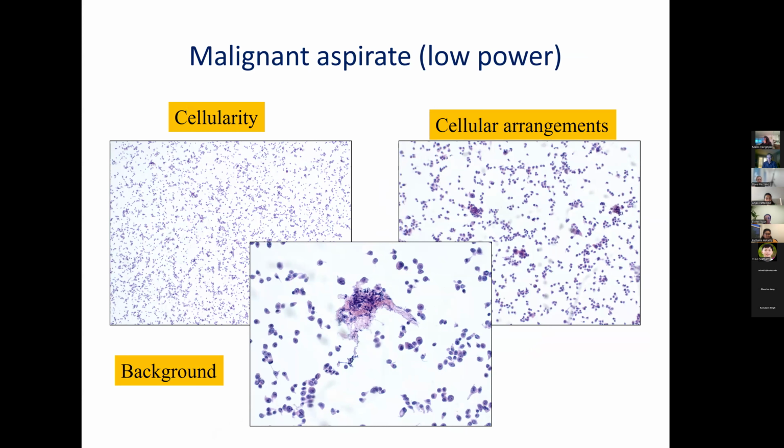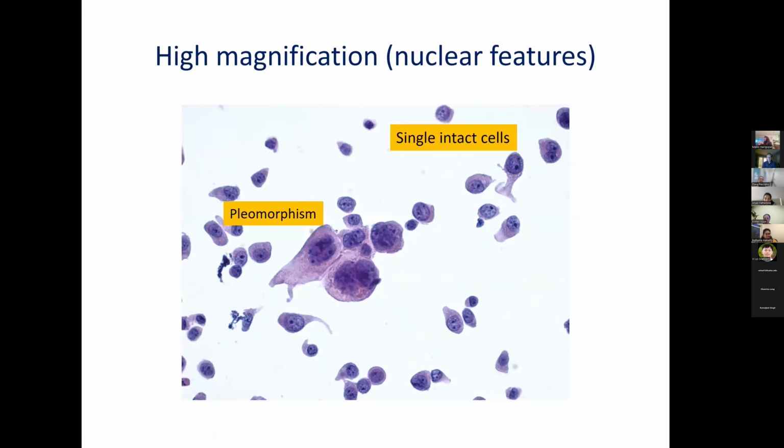And of course, you look at stromal components. Of course, there is no such thing that if you have tumor cells within a stroma, it indicates invasive. There are a lot of studies trying to show that these clues can help distinguish invasive from in situ. But on cytology, take my word for it, there is no such distinction. You can find benign glands in fat, but you're not going to call that malignant, correct? So you have to be very careful. You can only call something a ductal adenocarcinoma if you think it's malignant, without calling it invasive or specifying in situ or invasive. At higher magnification, you see how the chromatin looks very coarse.